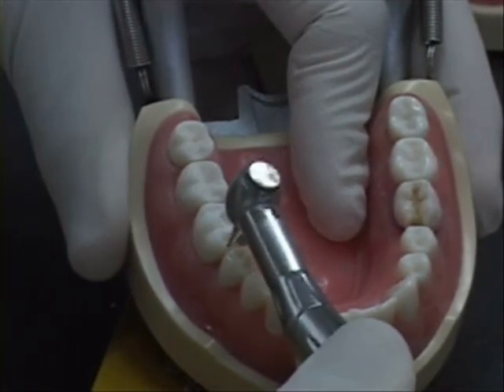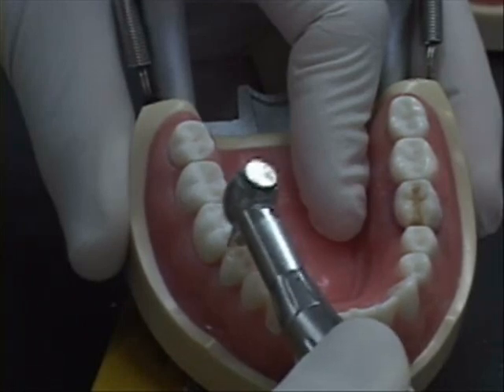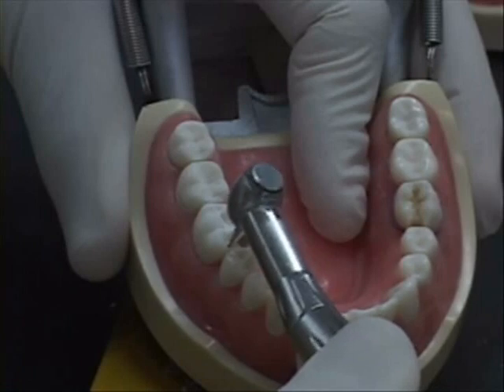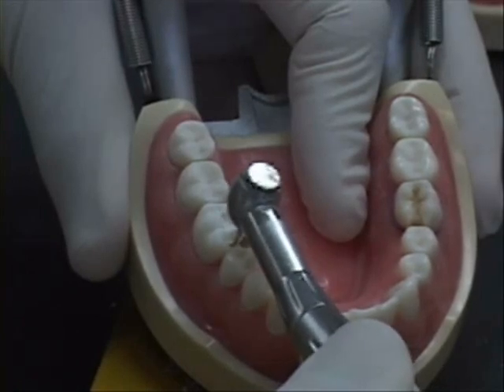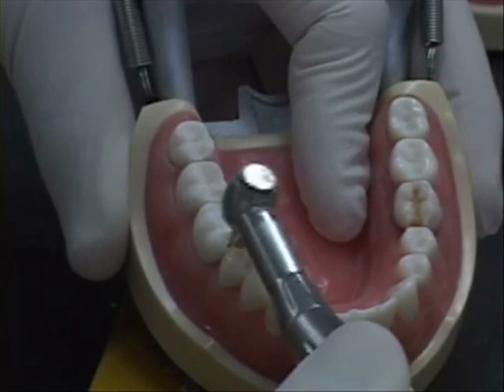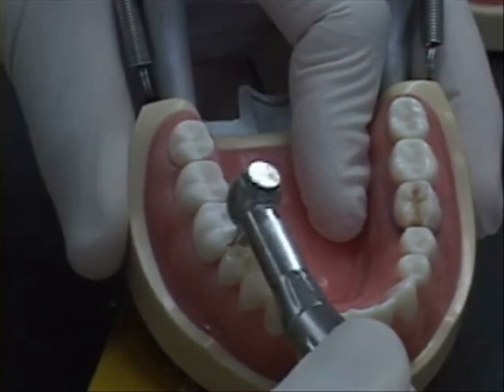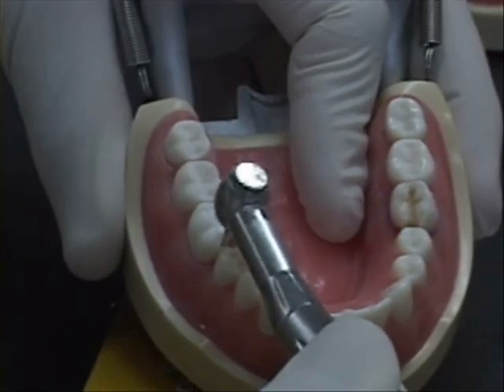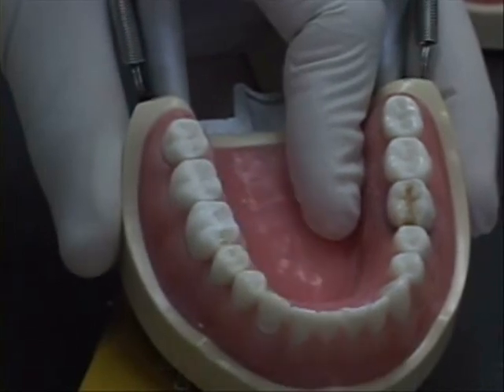Again, I lift this burr up to smooth that facial wall, go back and forth, making sure my floor is nice and even. Just use a very light touch by moving my burr very quickly and rapidly. And then if I want to smooth this really well, I slow my burr and stop it, but keep moving my handpiece.